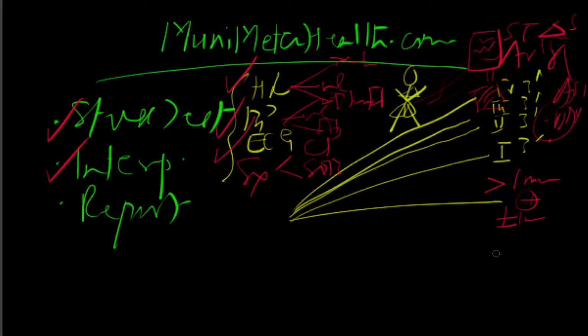Because remember, if you're just doing plus or minus 1 millimeter, then again the test will be non-diagnostic. Now, in my practice of 35-40 years of cardiology, my non-diagnostic report rate was about 5 to 7% only. And I really advised all my trainee fellows, where I was directing the programs, I always advised them, look, try to elicit more than 1 millimeter if you can. Otherwise, you're lost. You're back to square one where you started and say, look, I don't know what this test is like.